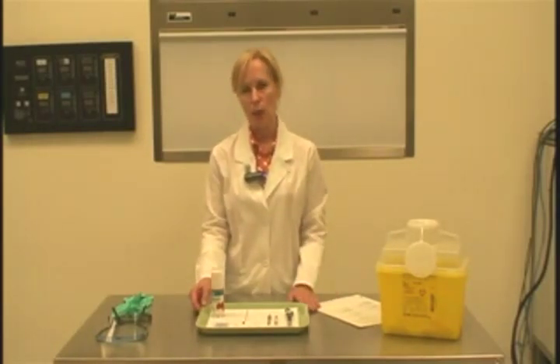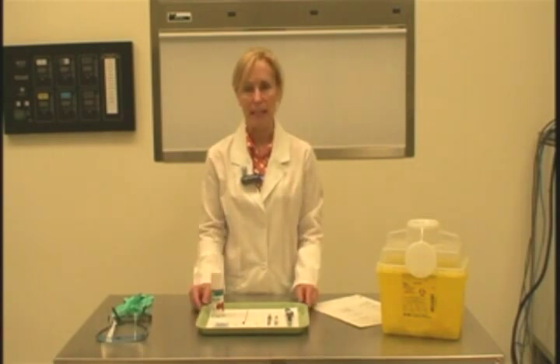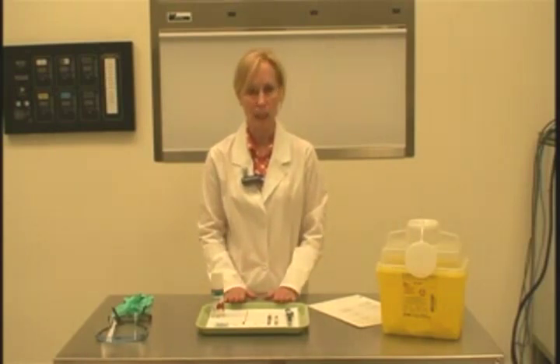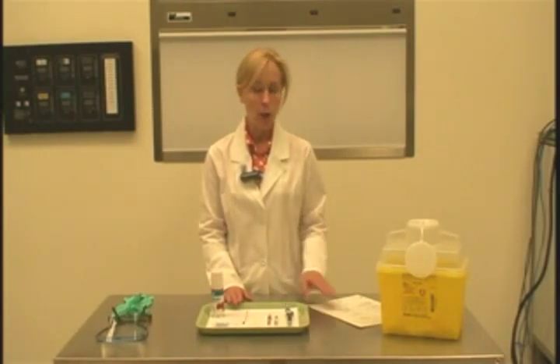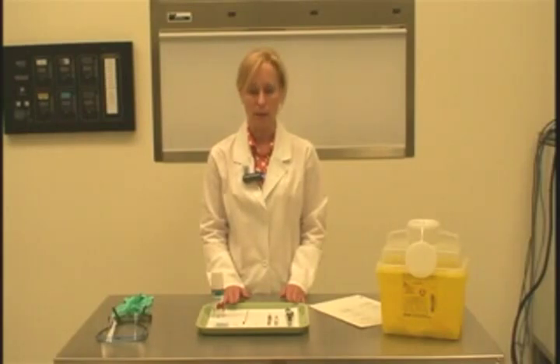The first skill step on the sheet is to come into our area, wash our hands, and assemble the armamentarium. I've already done that — I came in, washed my hands, and assembled everything needed for this procedure. I'm going to identify the different parts of the tray setup, and I encourage you to write down the elements of the procedure tray setup on your evaluation sheet for good reference.